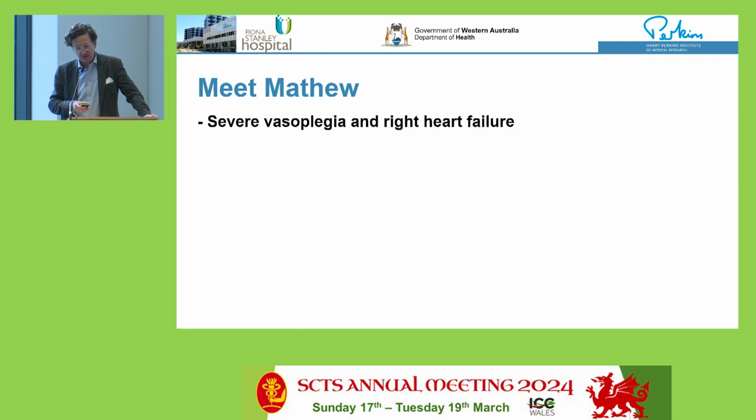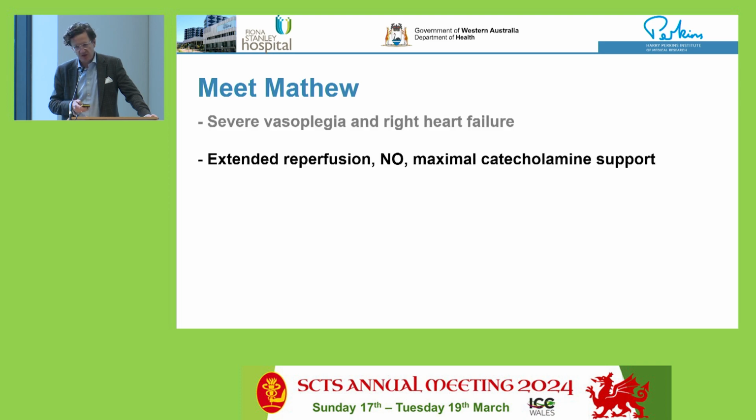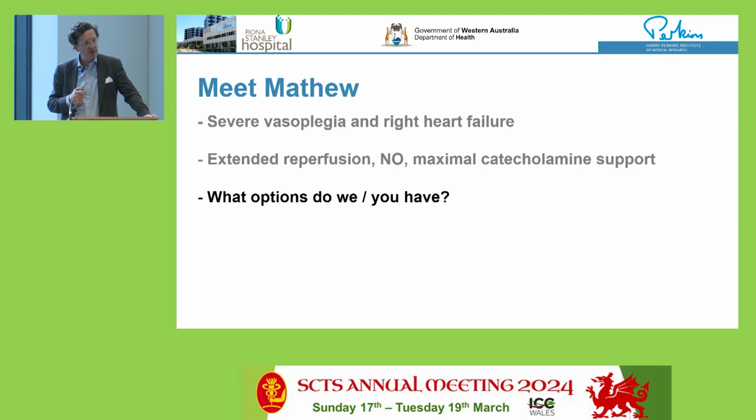However, soon after, the anesthetist tells you the patient is getting more and more vasoplegic, and then you look at the heart, and the heart has a profound right heart failure. So what do you do? You step aside, you say let's reperfuse a little bit longer, you do extended reperfusion, you use nitric oxide, maximal catecholamine therapy, and then you look over the curtain again into the chest, and you ask what options you have if you don't have advanced MCS as a backup solution. Of course, you can go to the bathroom and just pray and hope for a miracle. Well, we all know that's not very successful in the majority of cases.